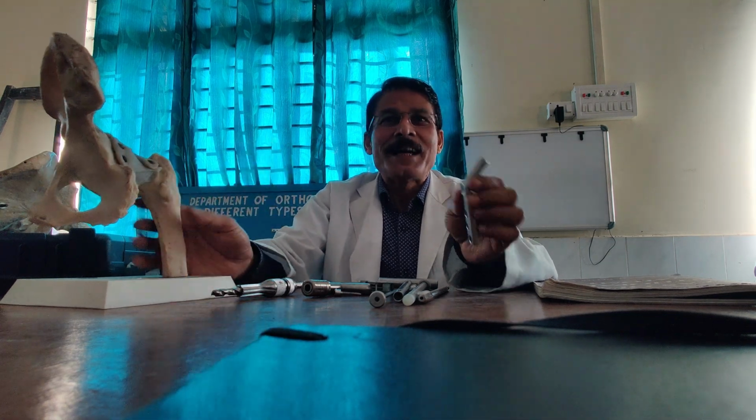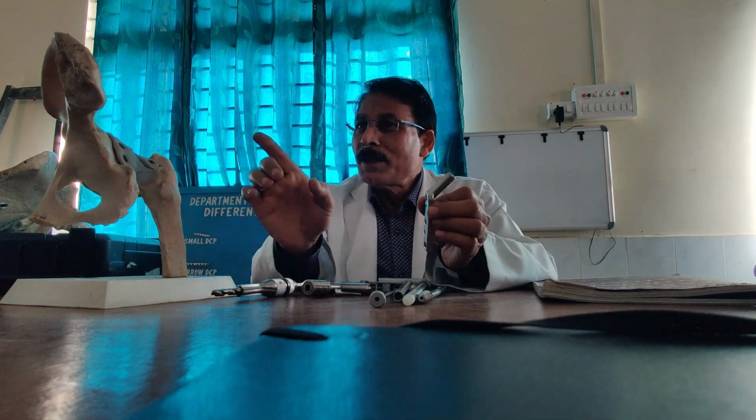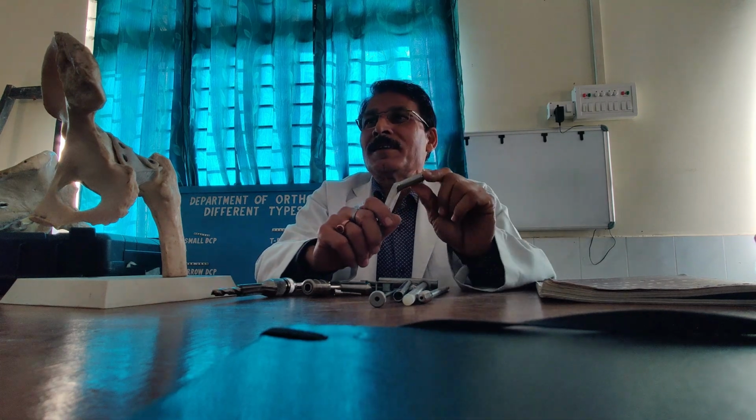Are you getting my point? Yes, sir. But ideally, I am supposed to place the plate in the axis of the weight bearing. Weight bearing and CCD angle are not the same. So that is why you are selecting the plate not corresponding to the weight bearing angle.